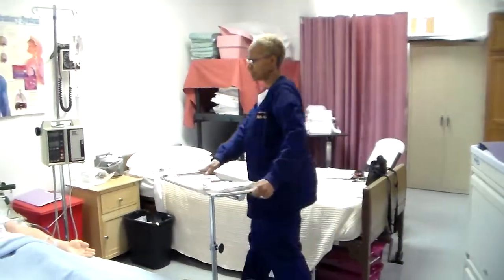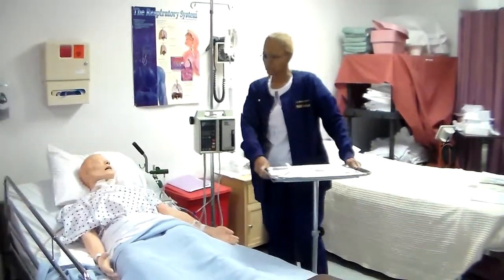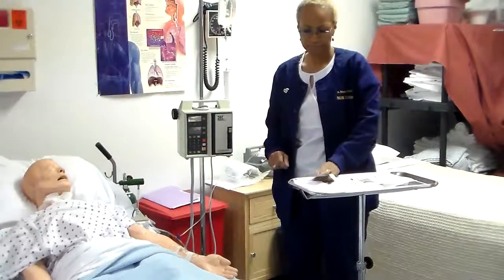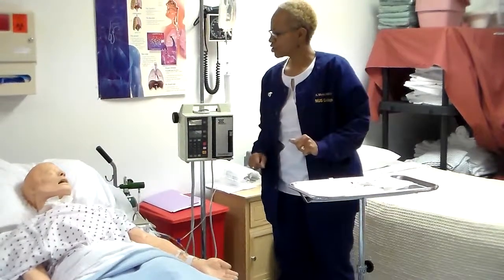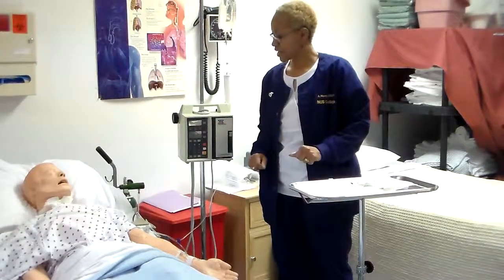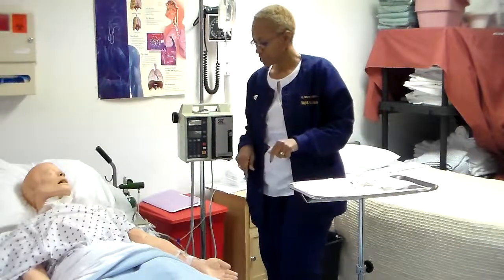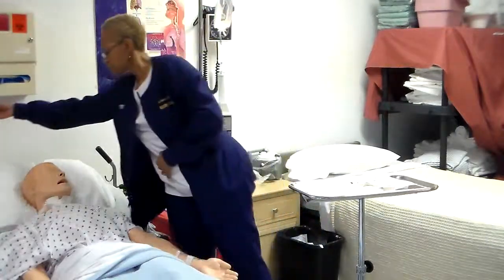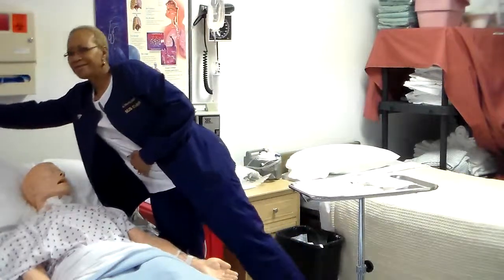Good afternoon, Mr. Johnson. My name is Annette. I'm your nurse for today, and I'm going to be giving you your IV antibiotic, and it's going to go through your present line, so you don't have to worry. I don't have to stick you. Let me just wash my hands. Excuse me for reaching over you.